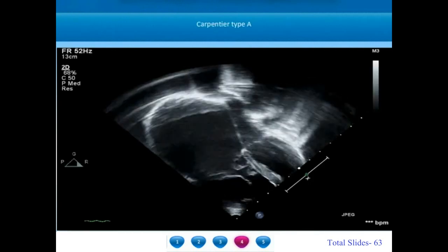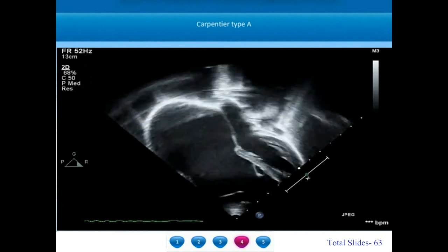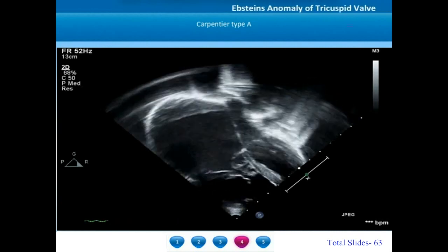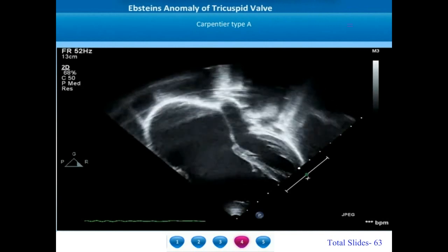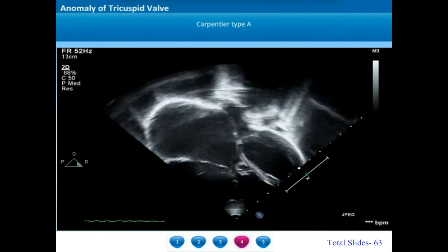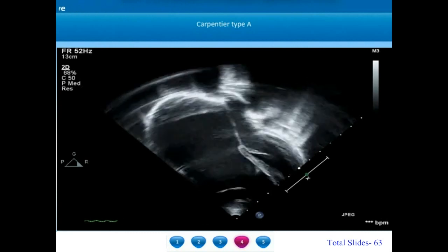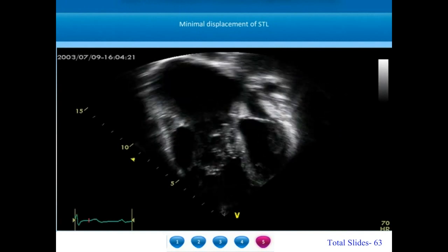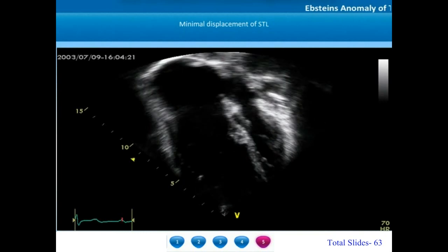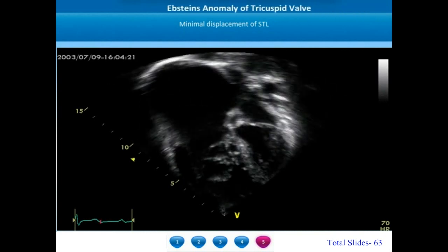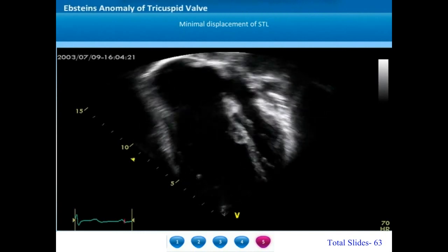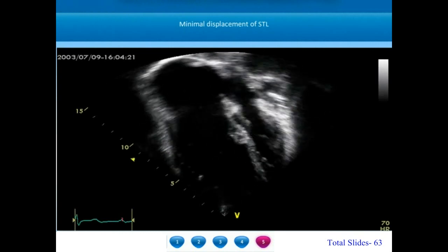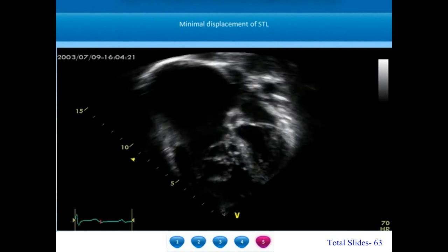The apical four-chamber view shows a Carpentier type A Epstein's anomaly. We can appreciate a minimal displacement of the septal tricuspid leaflet. The mobility of the anterior tricuspid leaflet is very good; the anterior leaflet is shaped like a large sail. The septal leaflet will be minimally displaced towards the apex with some tethering towards the right ventricular wall. Failure of delamination is the hallmark feature of Epstein's anomaly, however the anterior tricuspid leaflet retains normal good mobility.